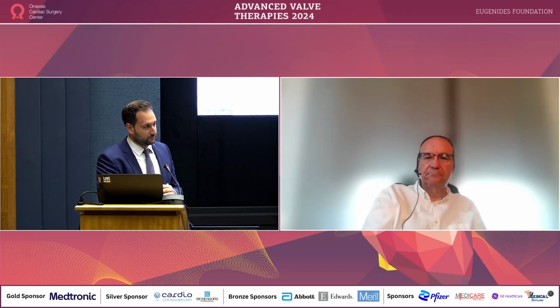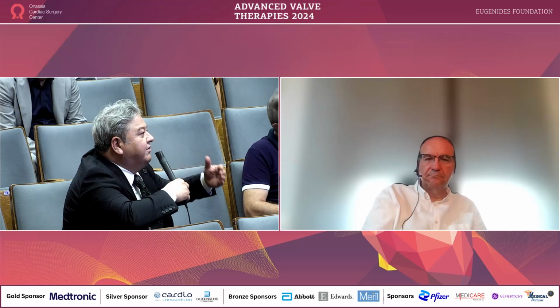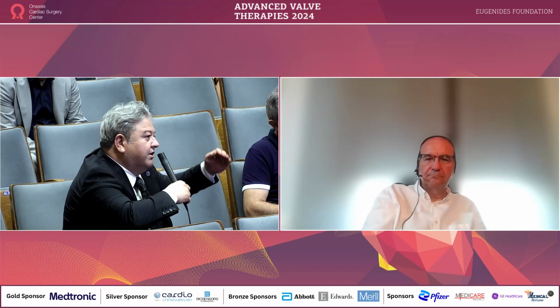But maybe, according to Yannis' question, this model can be developed according to the right cusp rule. You know, sometimes it's not very easy to find. Even when CT gives the right information about the correct angle of the tricuspid coplanar view, we sometimes give a great amount of contrast to find the appropriate angle. Maybe this program will help you. But in the first case, I was really very afraid that it was a very high implantation, so I wouldn't put the balloon expandable valve at that position.